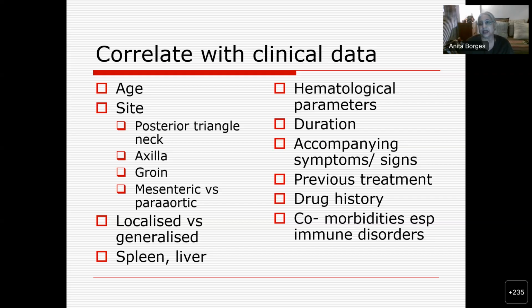Okay, by the time an axillary or a groin lymph node becomes evident, it's usually pretty large, and you will get a single or a group of potato-sized lymph nodes in the axilla and the groin, and you can just shut your eyes, and of course you have to look at your section, but shut your eyes and make a diagnosis of nodular lymphocyte predominance Hodgkin's. Okay, so this is, again, a single group of lymph nodes, axilla or groin, very seldom both together.